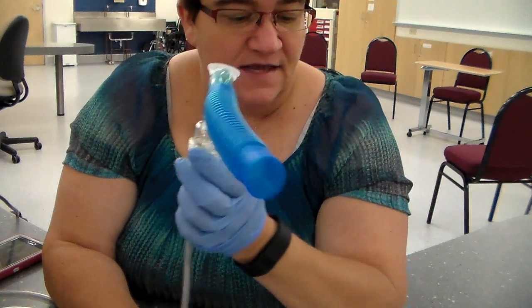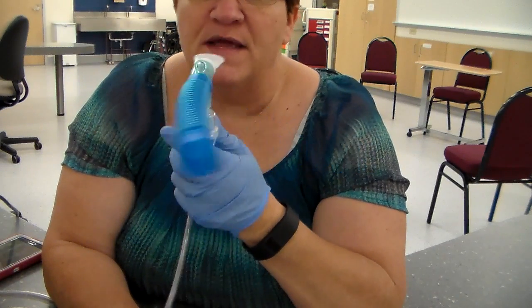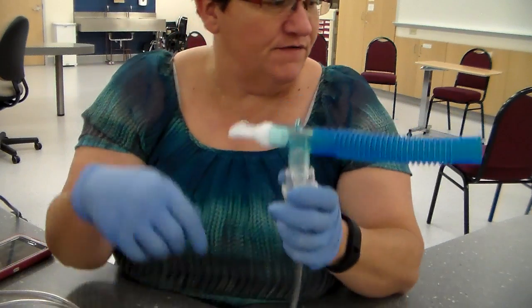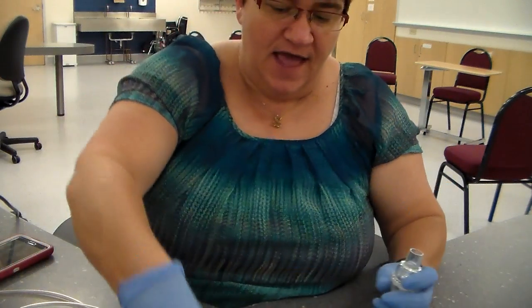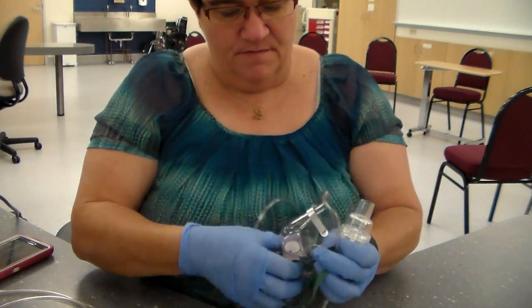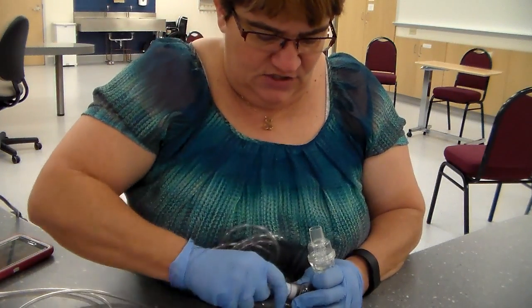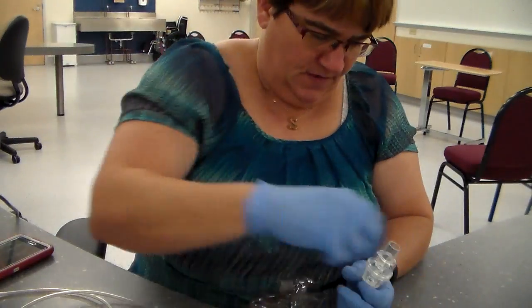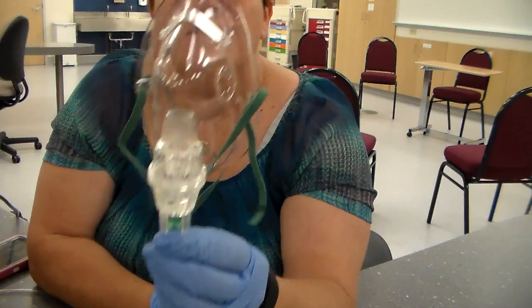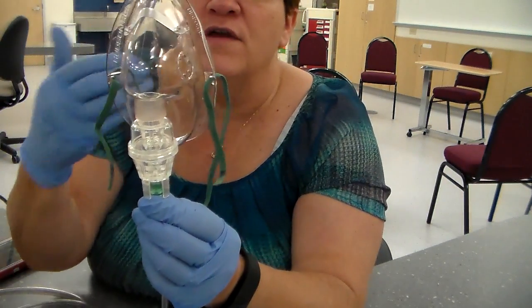Okay. So then what you want to do is you want to tell the patient to hold the mouthpiece in their mouth and close their lips around it, okay? Now if your patient's not able to hold this in their mouth for an extended period of time, you can take a mask, okay? And you can put the treatment onto the mask, okay? And it slides right onto the mask just like that, and then you can put it on your patient and they can breathe it in that way.